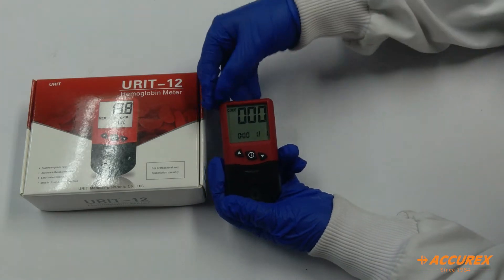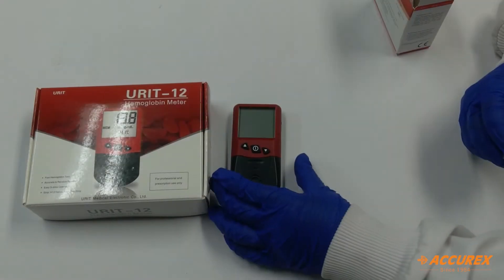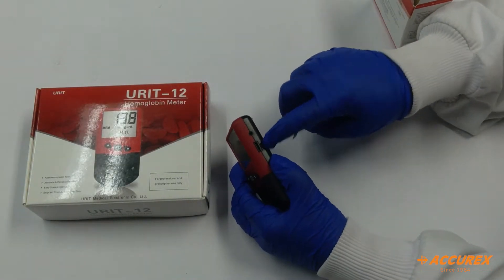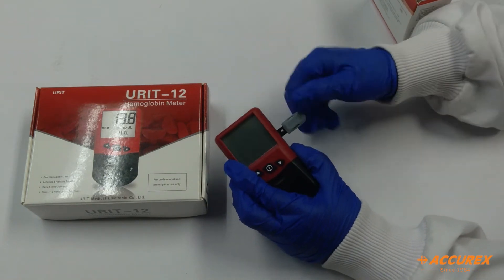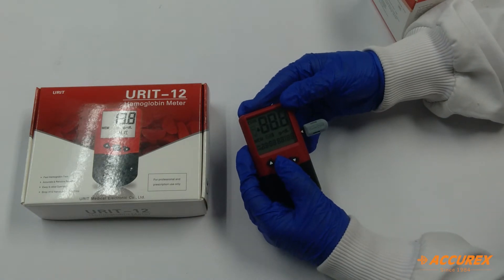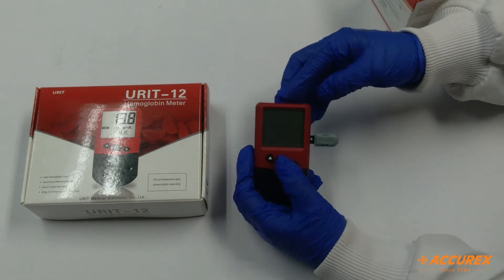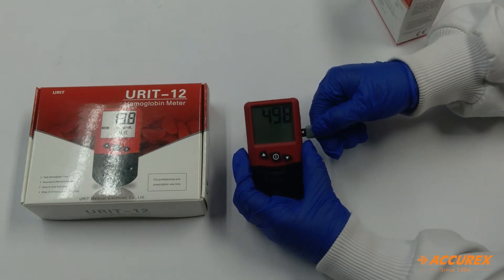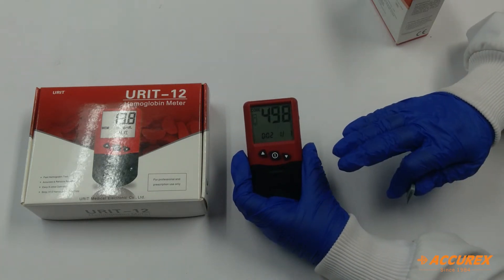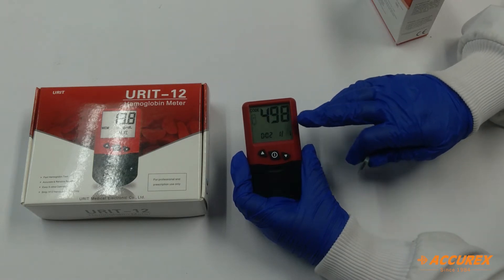Now it shows a code on screen, so we have to insert a code chip. We will insert this code chip into the given slot like this. The code number of the strip will be shown on the screen. If you remove this code chip, the code number will still be shown and you have to use the strips of the same code.